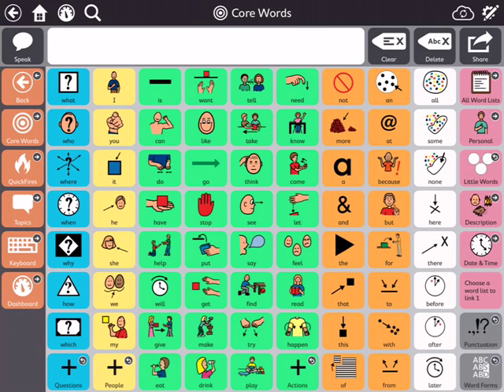So that is my presentation for today. I hope that helped you learn Snap+Core first, and I hope that you have some time to spend playing around with it yourself and trying to communicate by augmentative and alternative communication. Thanks.